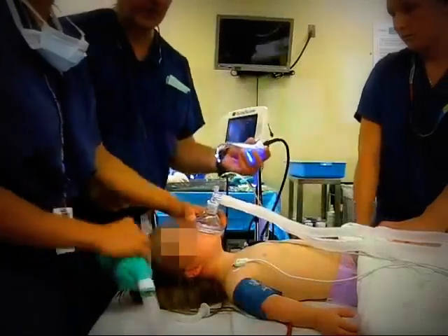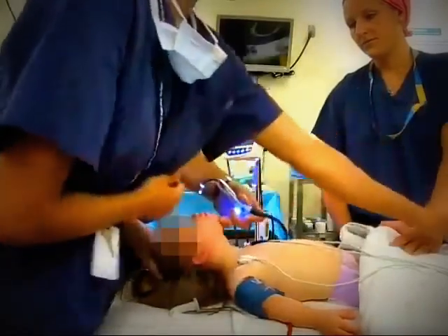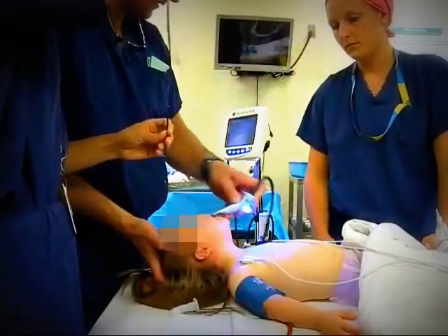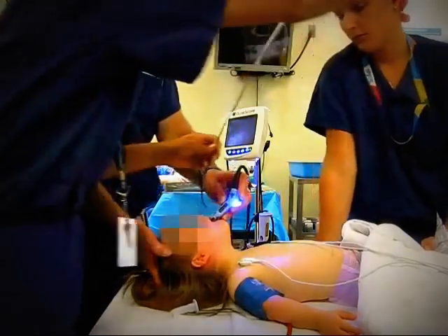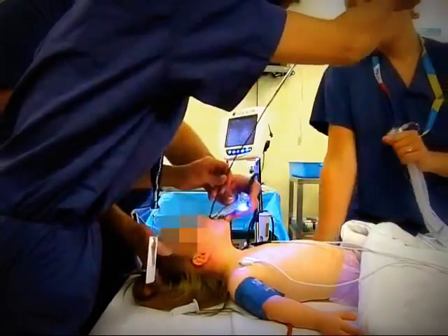The video laryngoscope-assisted fiber optic intubation is a two-person technique. With the patient pre-oxygenated, the video laryngoscope blade is inserted in the mouth and a view is obtained. The fiber optic scope, with the endotracheal tube loaded onto it, is then inserted in the mouth or the nose in a midline position.